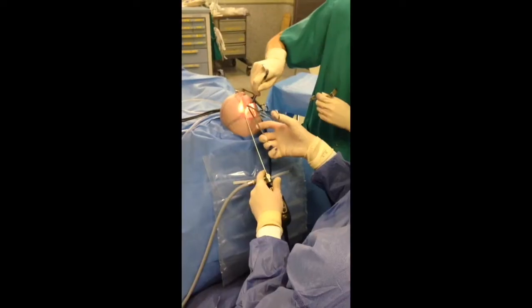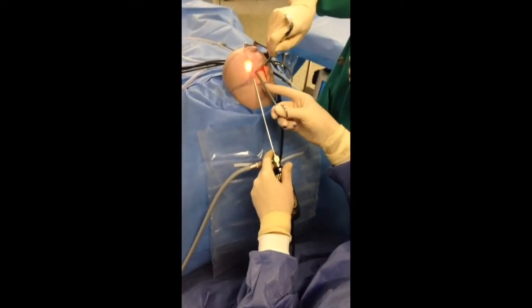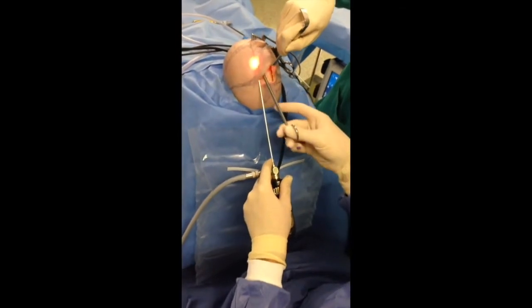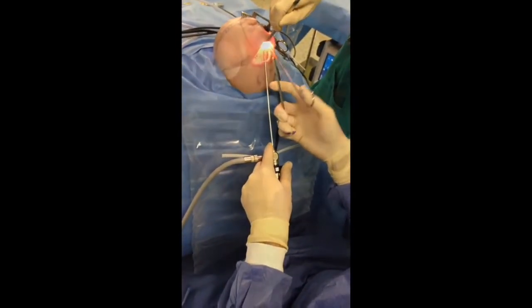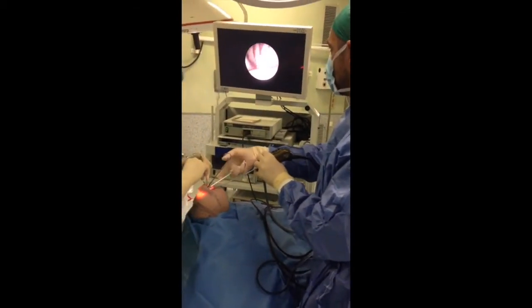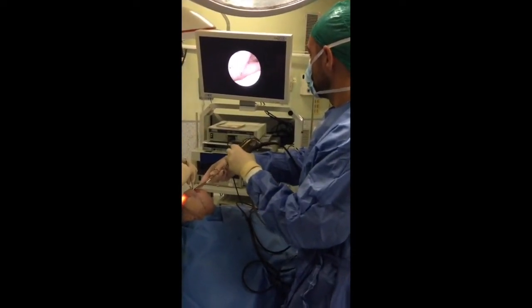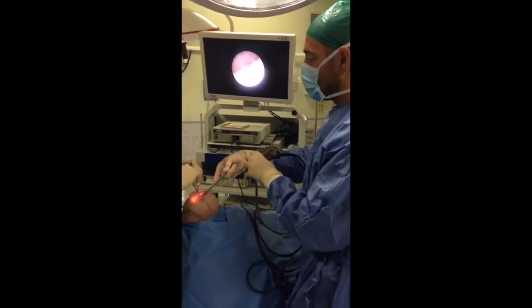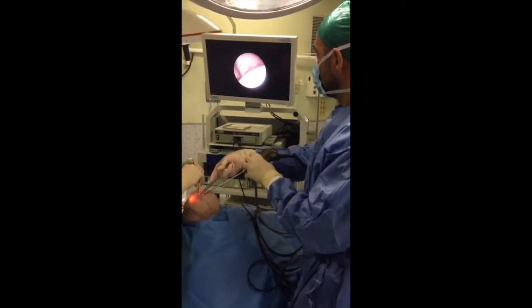Endoscopic technique. The first step is the dissection of skin and galea from the bone. This phase can be done with direct vision or with rigid endoscope assistance. The second step is the dissection of the dura from the bone. The endoscope is used to take out some emissary veins along the way that can be coagulated with bipolar forceps. This step may reduce the blood loss.